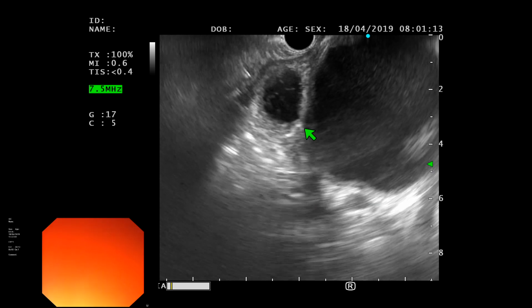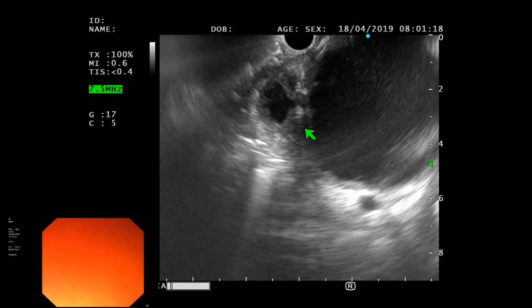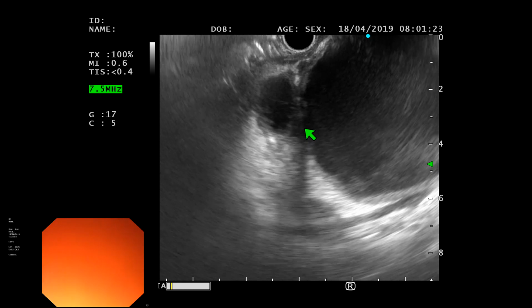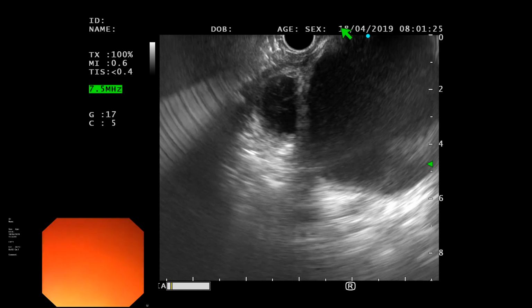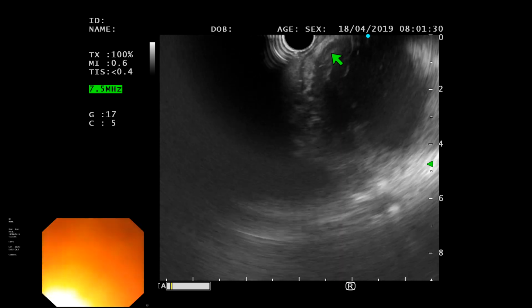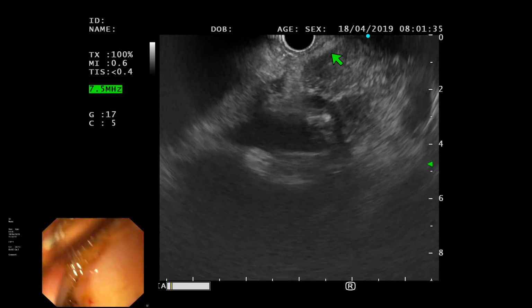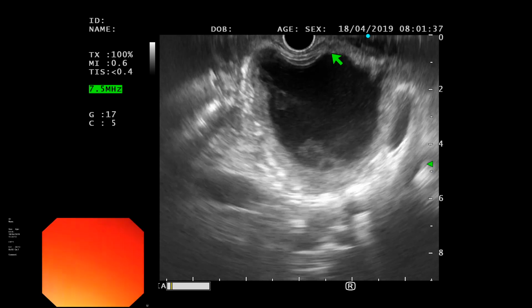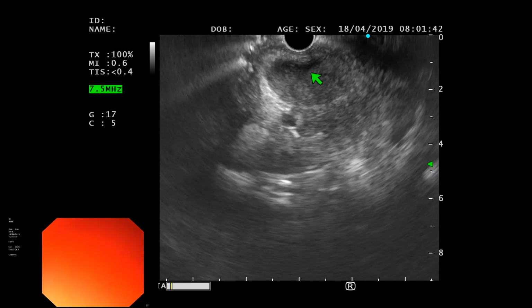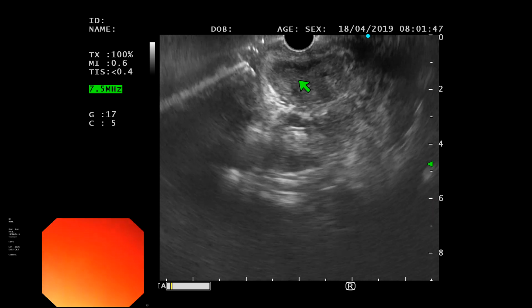You see that? I was told it's a small cyst. It is small. It depends on who you ask, I guess. No, it was the CT scan that said that. And no, it's really quite a large cyst, not a good exam for demonstration. Yeah, but as we were discussing, it may have grown since the CT scan. You are very kind, Mustafa. If the CT was yesterday, that's the problem. No, it could have grown since yesterday. If you are kind, then stay kind.